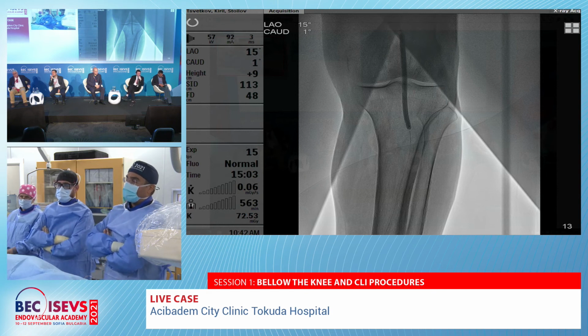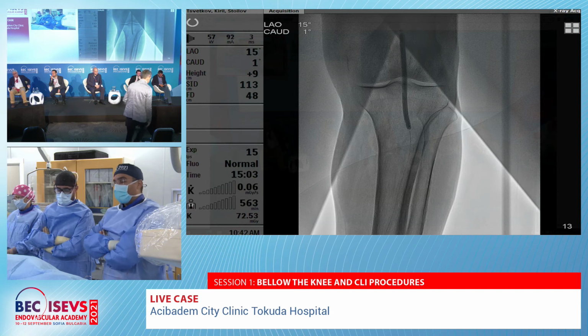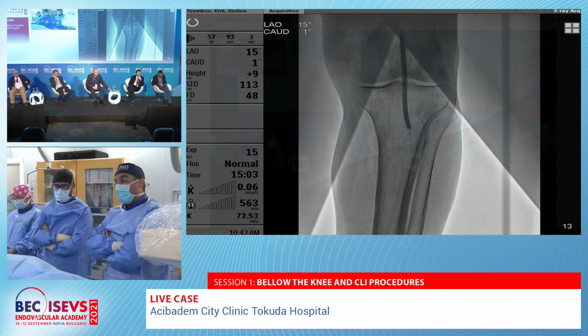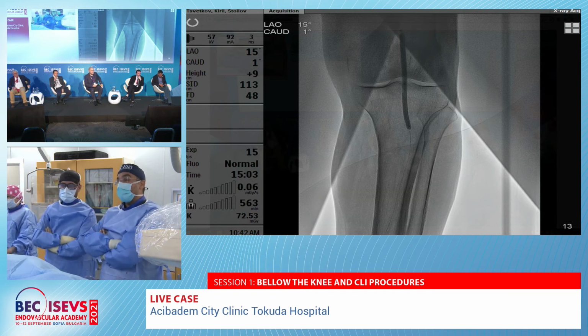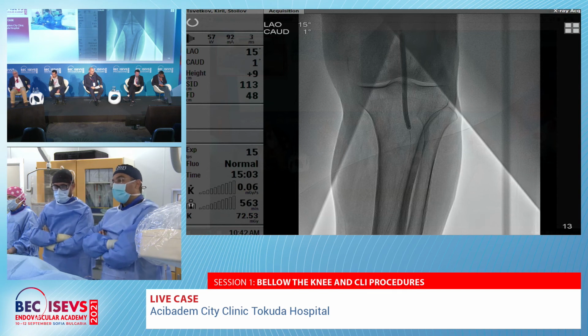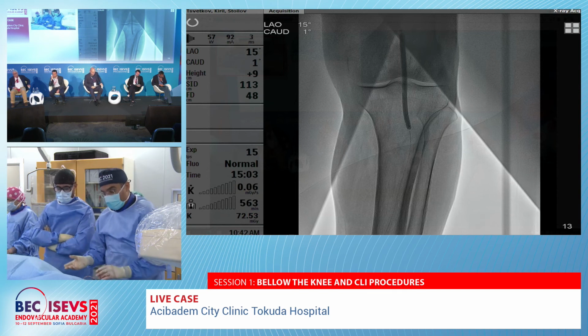The scoring balloon is a good idea if you don't have, let's say, atherectomy devices or the ability to use covered stents. However, in really calcified long CTOs, I still believe as a vascular surgeon that a good vein is the best solution. However, I would like to hear your opinion about this.